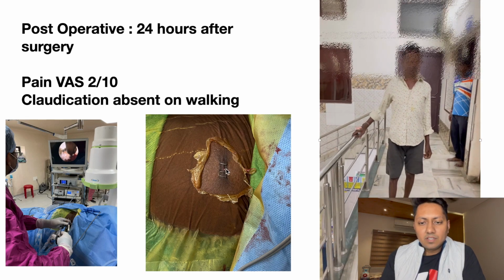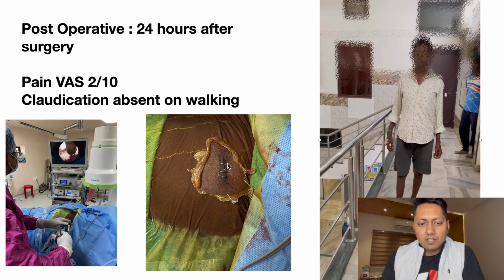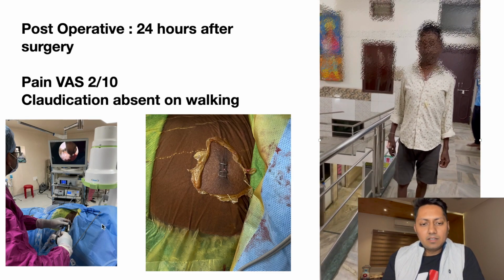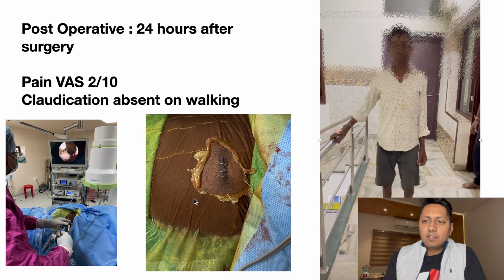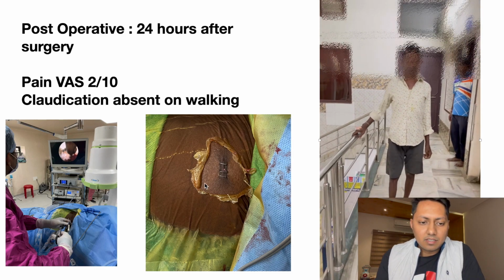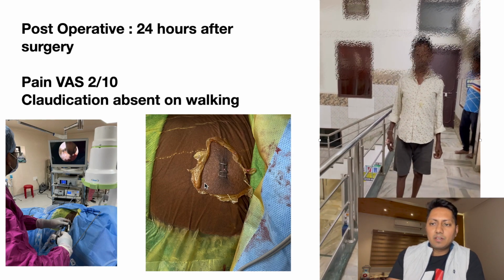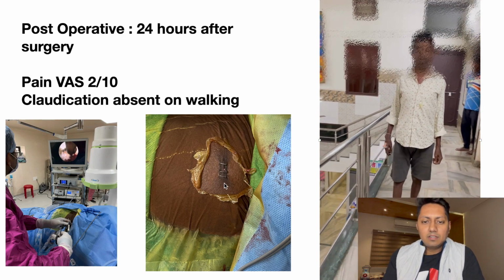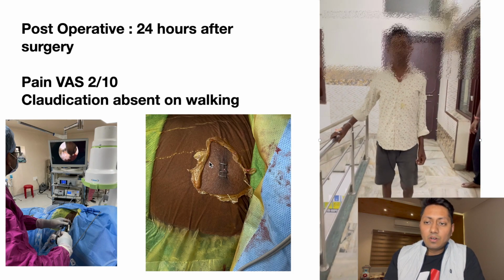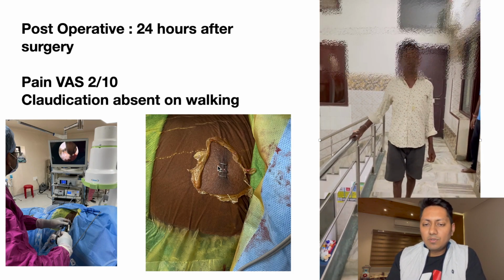This incision is only 1 centimeter long, a single incision for decompression of 2 levels, and done under local anesthesia. Many surgeons feel that this case needs fixation, fusion and deformity correction, but this surgery is a very good example to show you that not all patients need fixation and fusion.